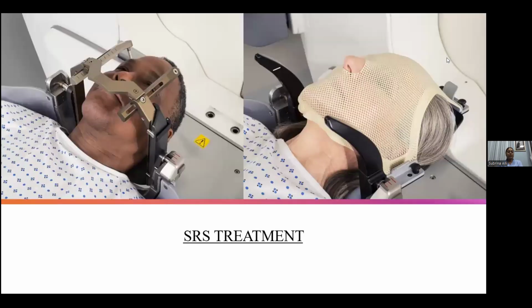So this is a picture of the frames that we use. The one to my left would be the frame system where they have 4 pins that are attached to the patient. It is a bit more invasive than the one to my right, which is the frameless system. The frame system has the advantage of offering the least mobility for the patient, whereas the frameless has the advantage of being least invasive, but still has that mobility aspect for patients.